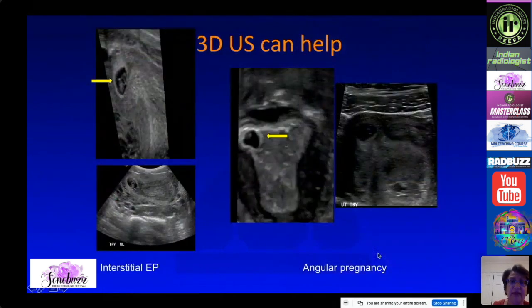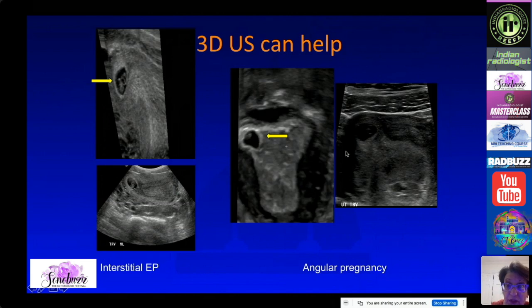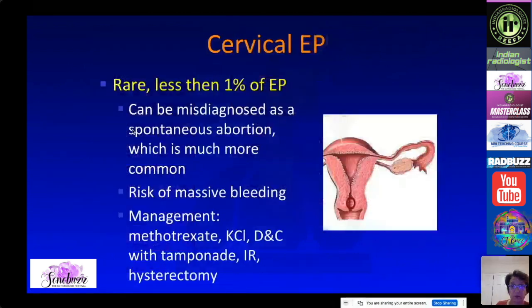3D ultrasound can help differentiate these entities. In the angular pregnancy case, 3D shows the sac is still within the uterus but at the edge, with some myometrium surrounding it. By contrast, the true interstitial ectopic pregnancy is more eccentric with no myometrium on the lateral aspect.